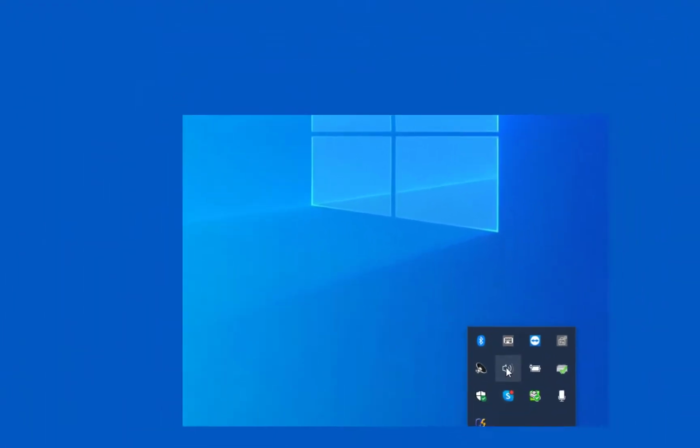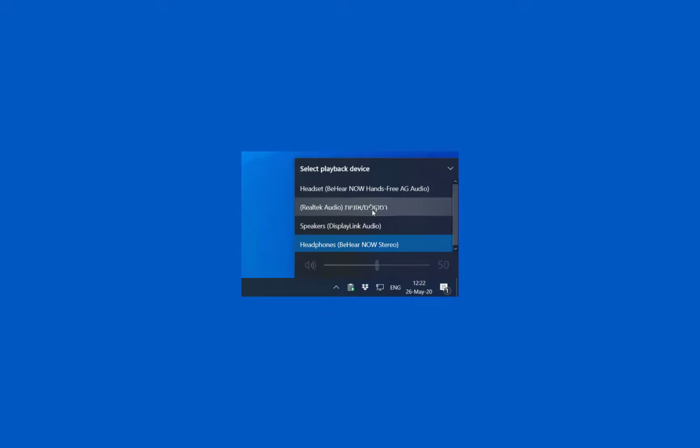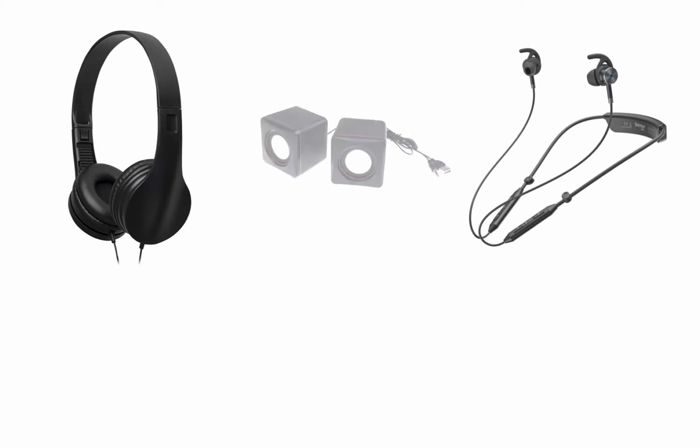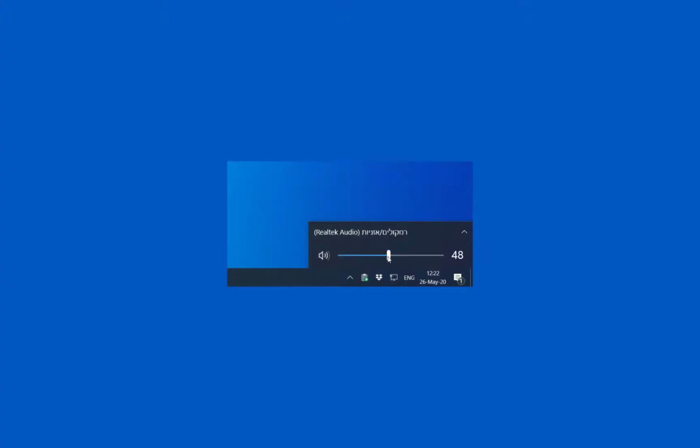For the masker sound playback, TinnMasker will use your computer's default playback device. It can be good quality wired headphones, Bluetooth headphones, or a loudspeaker. Check if your playback device is connected properly, switched on, and the volume is, preferably, in the middle position.